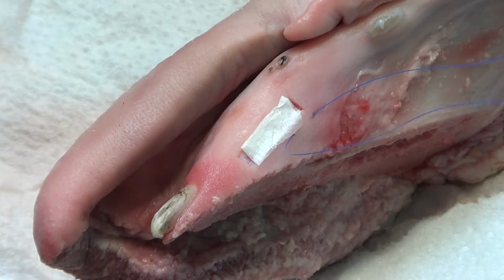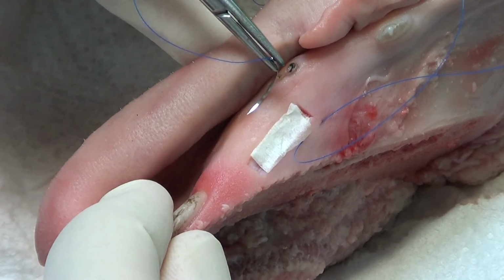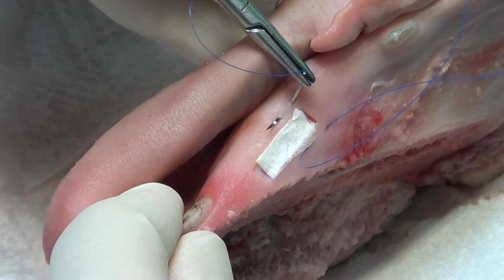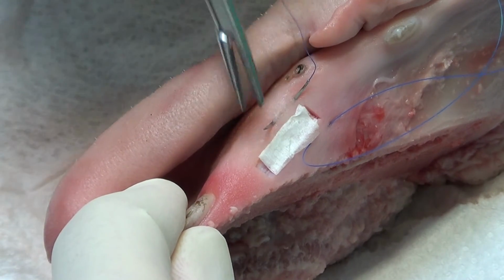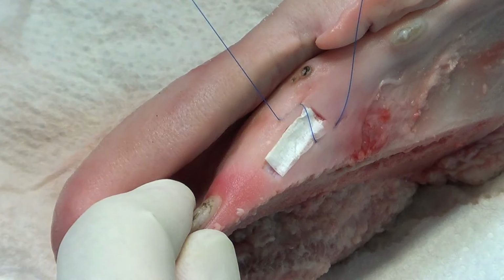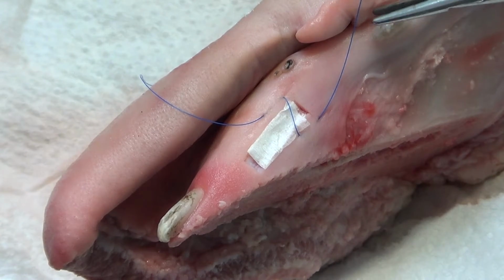Then we go coronally between, imagine to have the molar here, between the molar and the first incision. We re-enter distally and we re-exit mesially. And so at the end you can close the cross suture like I showed you before.